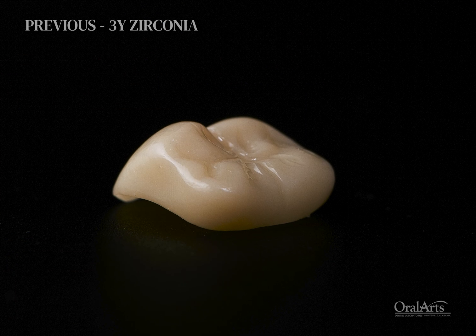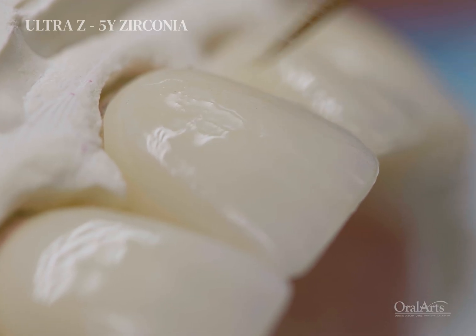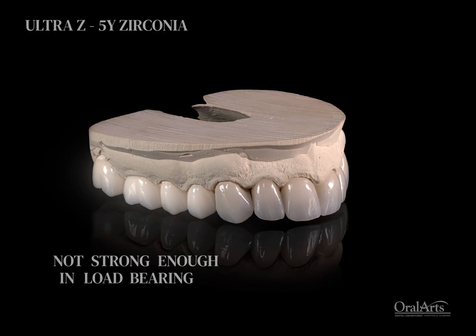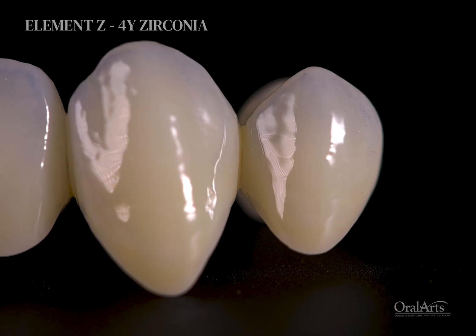3Y Zirconia is really strong but it's opaque and not very translucent, and 5Y Zirconia is really beautiful and translucent but not strong enough in load-bearing areas. So what you want to achieve is something in between that looks beautiful but strong.